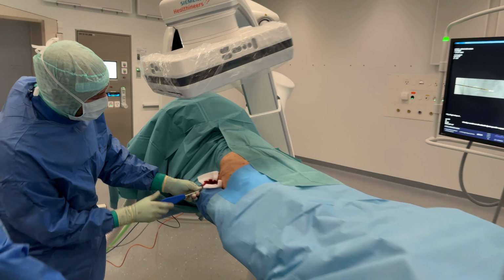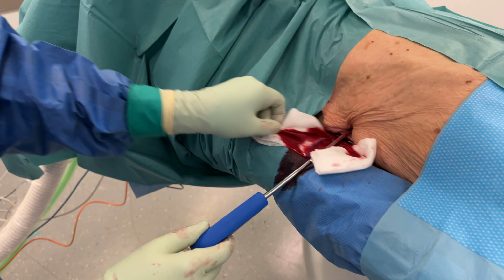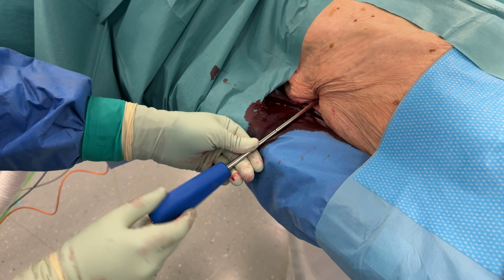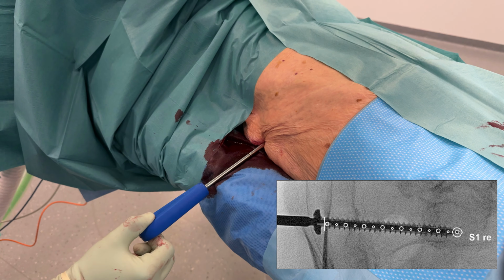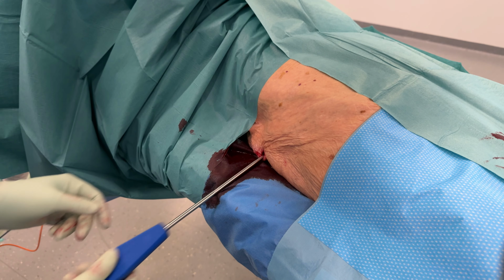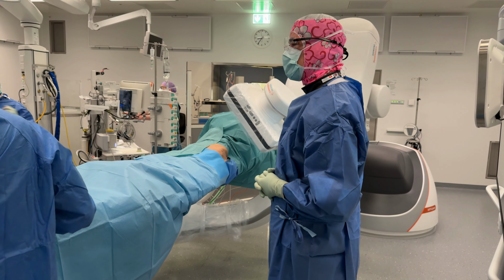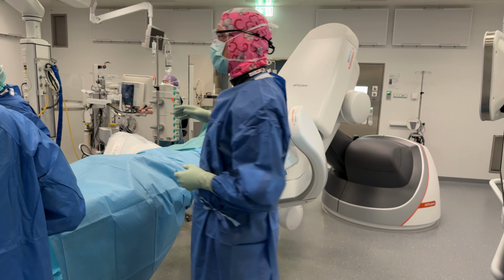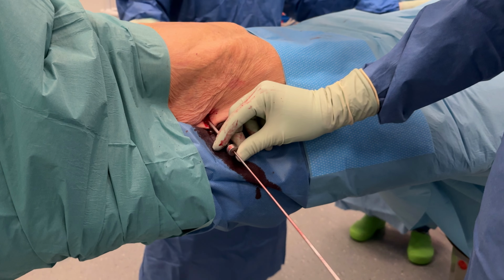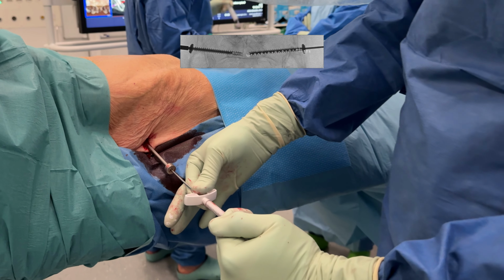To check the snug seating of the washer on the outer cortex of the ilium, the C-arm is positioned anterior-posteriorly with a 20 degrees tilt to the ipsilateral side. There may be no tactile feedback due to osteopenic bone. Then a screw can be done on the contralateral side in an analog fashion. To increase pull-out force, the perforated screws may be augmented with PMMA.